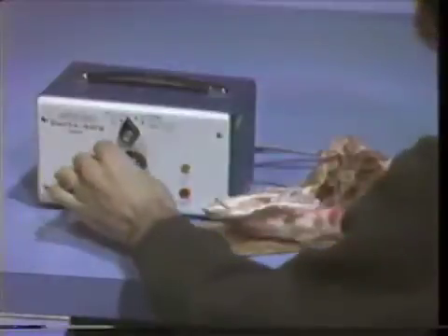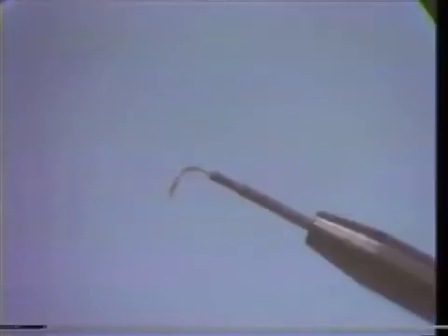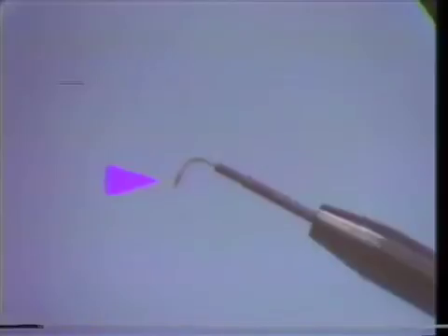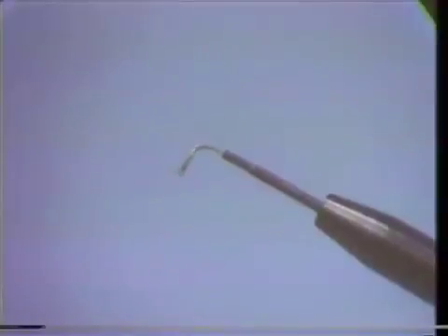By turning the power down and making another incision, the tissue sticks to the electrode when the power is reduced too far. Here we show the tissue adhering to the tip of the electrode after cutting with the output of the unit at too low a value.